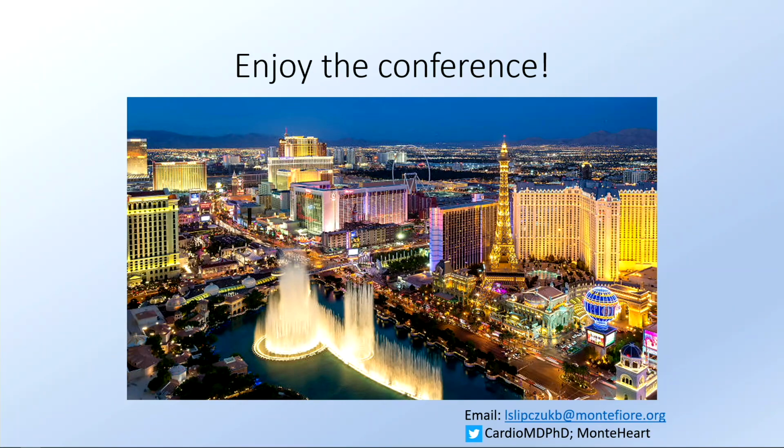Yeah, so that's a very good question, actually. So we do most of the measurements for the annulus with the traditional images. As far as I know, there are no studies evaluating the different measurements with different mono-E's, because it will affect the value of your annulus.